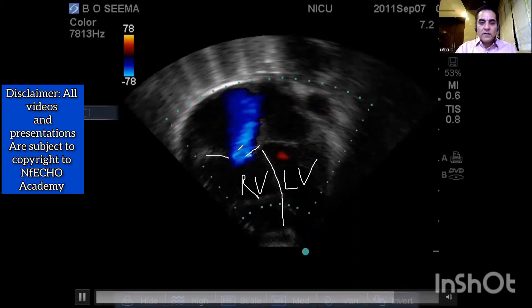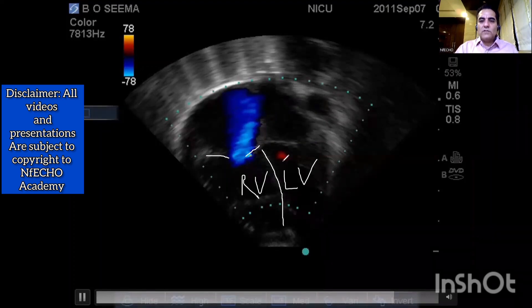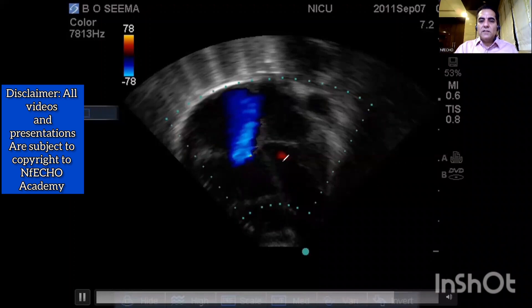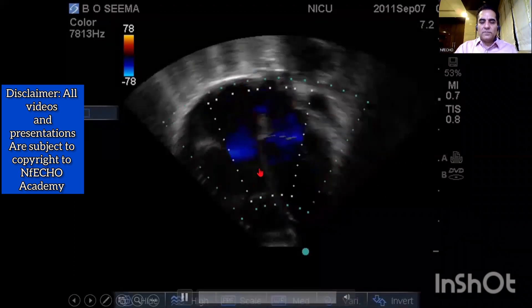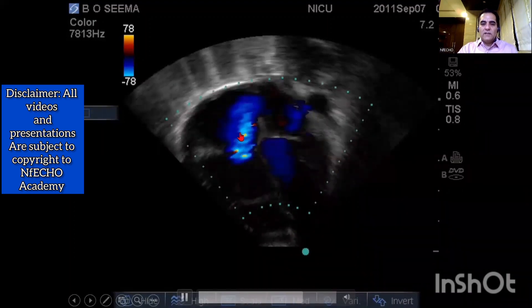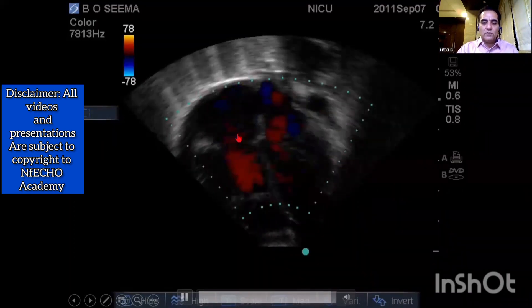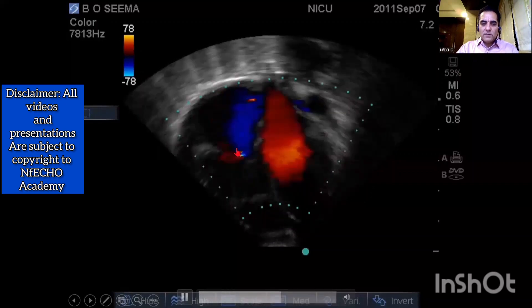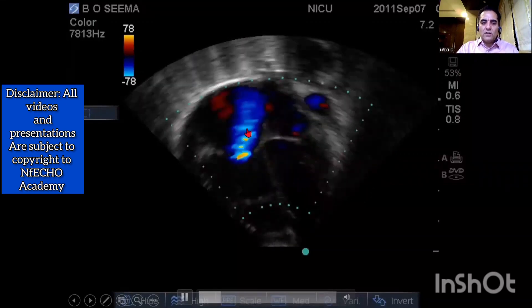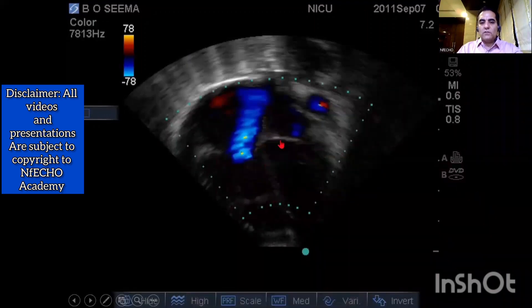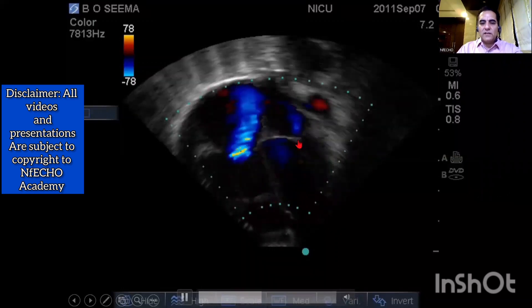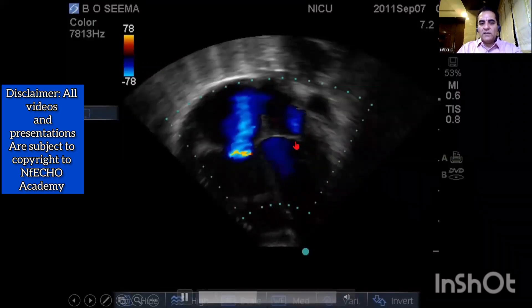In this apical upright four-chamber view, to calculate the TR jet, I will place the continuous wave Doppler within the blue jet of the tricuspid valve. I will calculate the pressure gradient between RV and RA using continuous wave Doppler. The TRZ is blue because the blood is flowing from RV to RA, which is away from the probe.